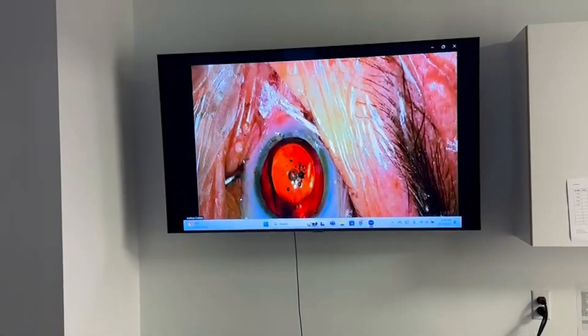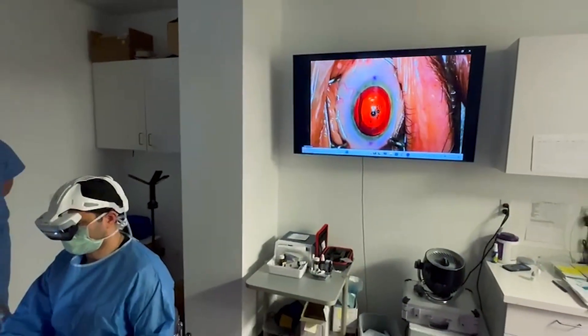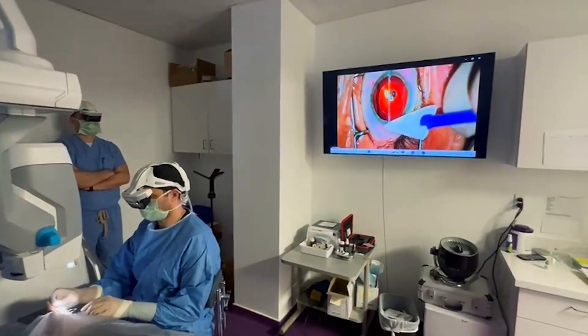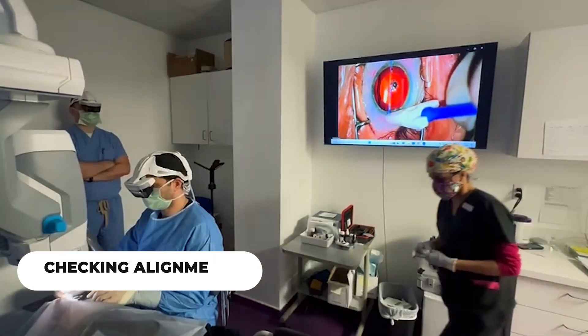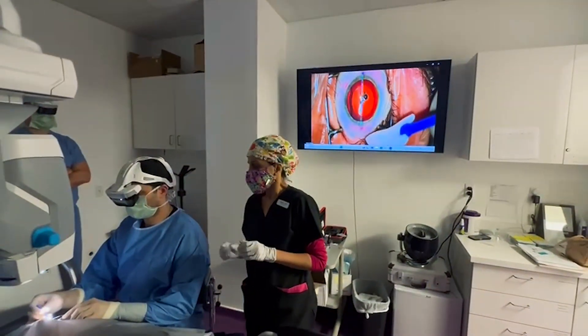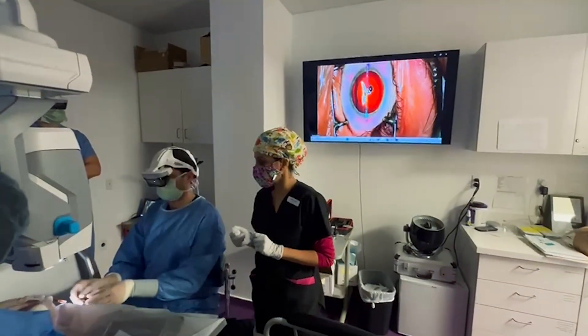Then after this I tuck those little four edges under the iris — that part was not shown here in the video. Here I am just checking the wounds and making sure everything is nicely sealed and that the axis is perfect. There are little alignment markers on the lens to make sure it's lined up with the vertical line there — in real life it's actually horizontal. The whole thing takes just a few minutes, and this patient did great.